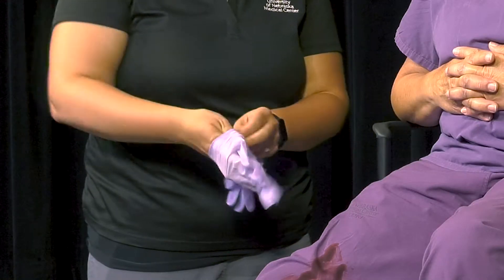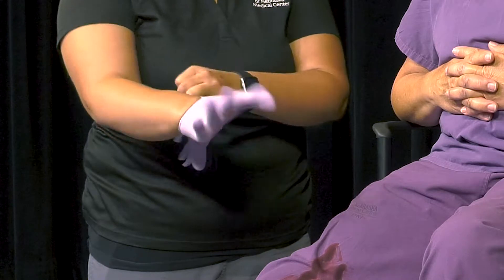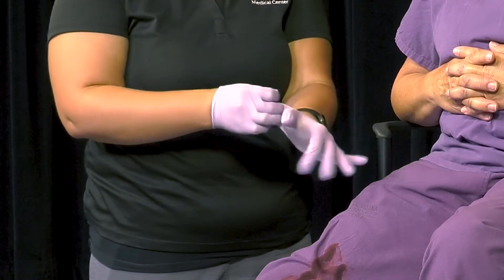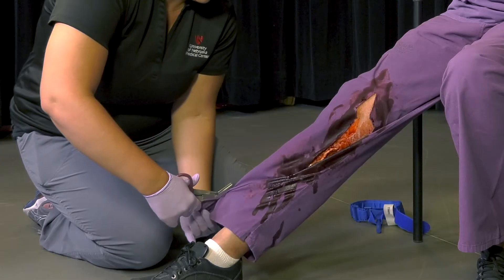Prior to applying the tourniquet on a victim with potential life-threatening bleeding, you should protect yourself by putting on gloves. Once gloves have been donned, expose the wound. You may have to cut the clothing off to expose the wound.